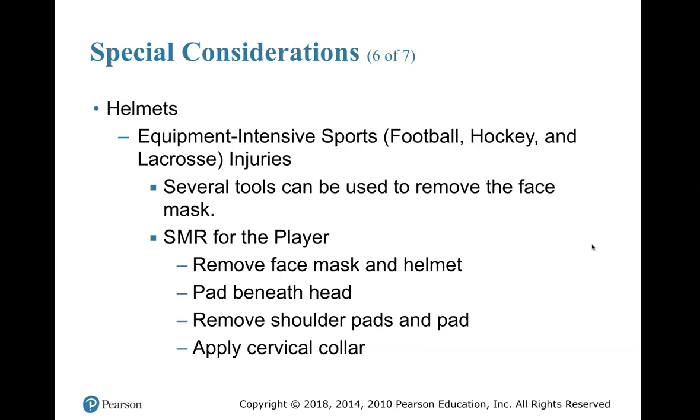Remove the face mask and the helmet pad beneath the head. Remove shoulder pads and the pad, whatever that means. Remove the shoulder pads and any pads around the player and apply a cervical collar.